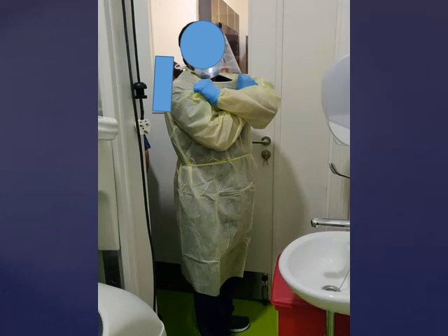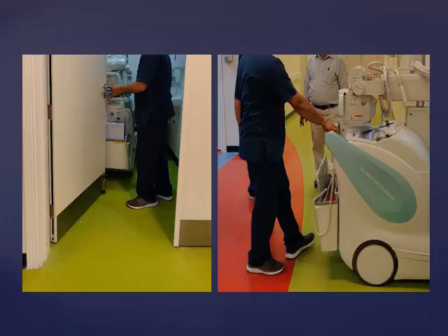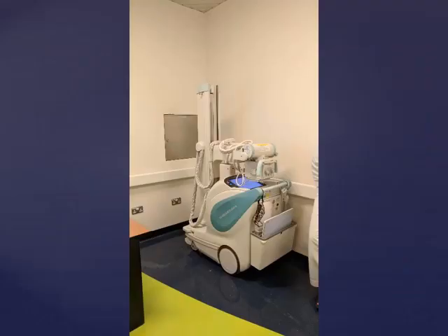Once you clean the machine, proceed to doff. Donning and doffing guidelines should be followed — the CDC has a very good illustrated guide on their website, and this should be practiced multiple times before performing a procedure on a patient. Proceed to remove the gown and the gloves, then remove the face shield and the face mask. Wash your hands thoroughly, and now you are ready to move the machine into the ward corridor. You have now completed a quick and safe examination. Replace the machine into the dedicated area of the ward to allow for 30 minutes of decontamination and passive air exchange.